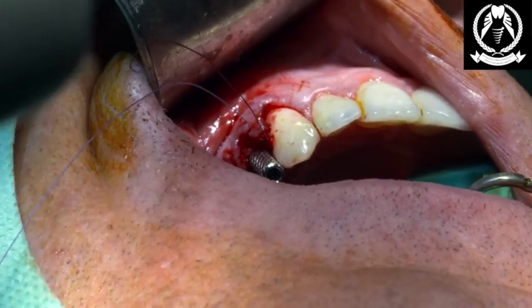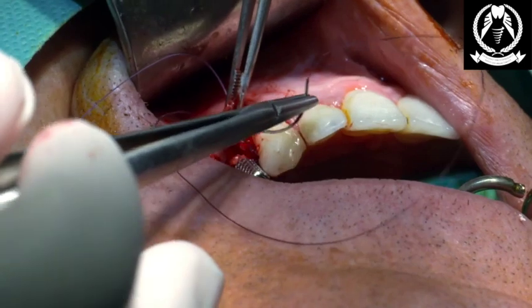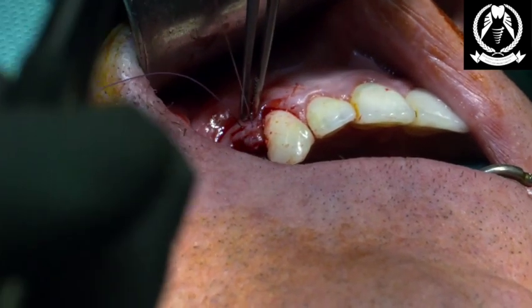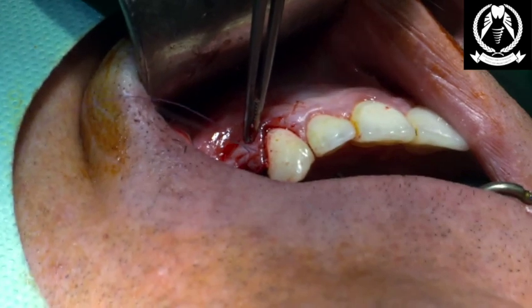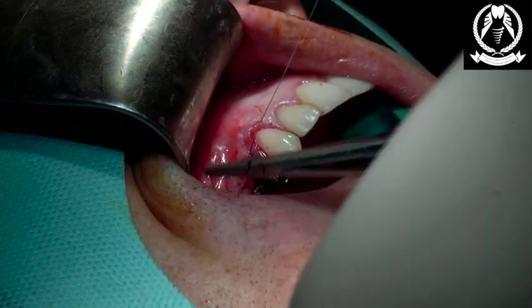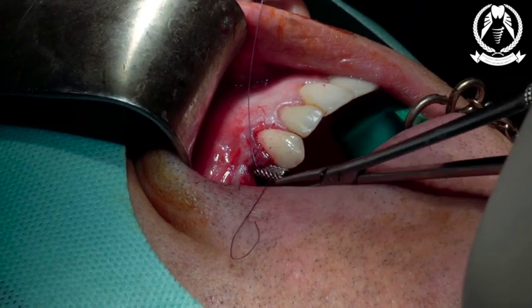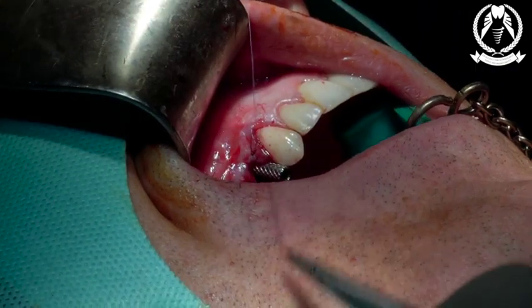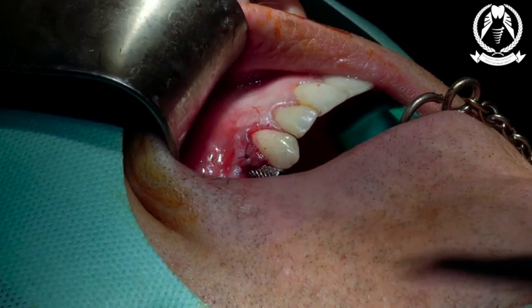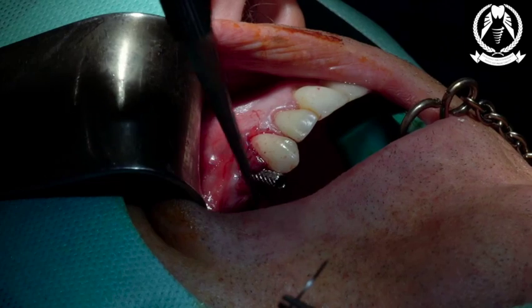Okay, so what we're doing is a vertical cross mattress now, just to hold your papillae up. And the papillae should nicely form anyway there. Okay, and there we go. Just tie that off in this direction. Just one more going across there. Perfect. Good. Cool.